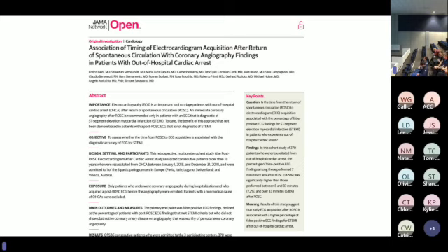So this was a cohort study that showed that if you did the ECG immediately after ROSC, it had a high rate of false positive ST elevation ECGs, thought to be just from the downtime and the shocks and the adrenaline that these people are getting. They only took patients who had ECGs before cath lab. So again, I'm not sure exactly the significance, but it was interesting that they recommend waiting 8 to 33 minutes after ROSC to repeat your ECG, which I guess if you've got a patient in the resus bay in the middle of the day in a cardiac centre and you've got an ECG like that, what are you going to do? But just thought it was an interesting article.